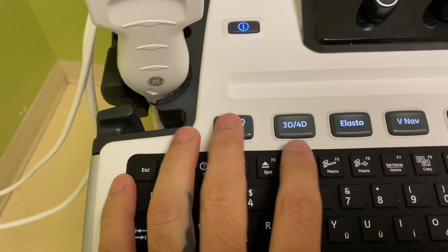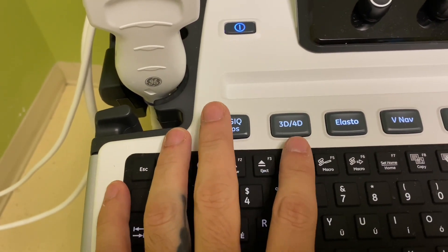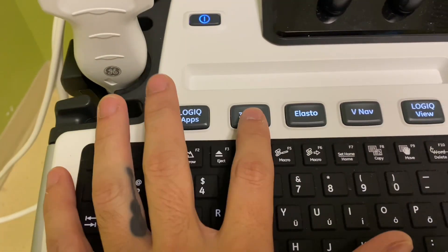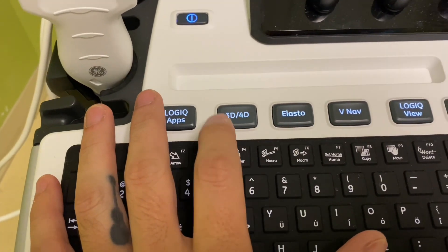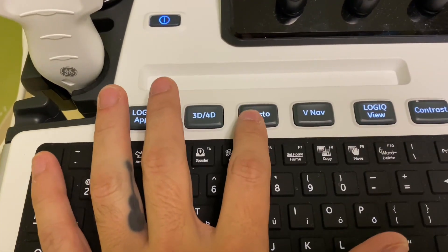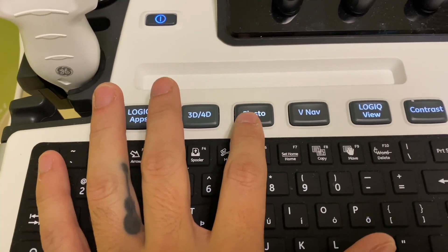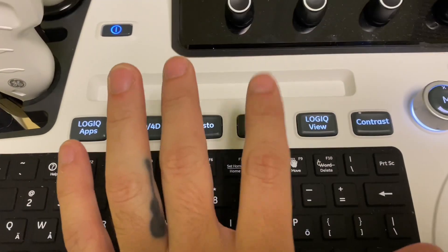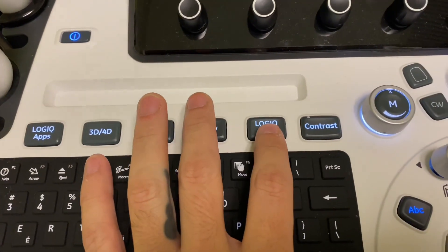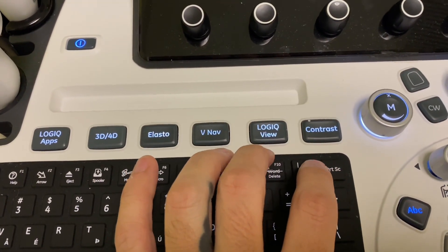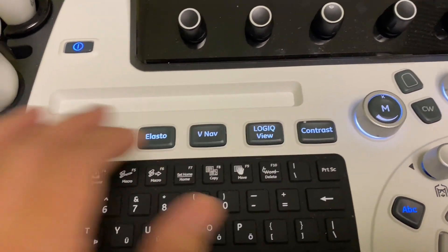3D 4D button is obviously for that 3D probe. Elasto is for elastography, never use that. Logic View, this is for panoramic views. Let me show you real quick.